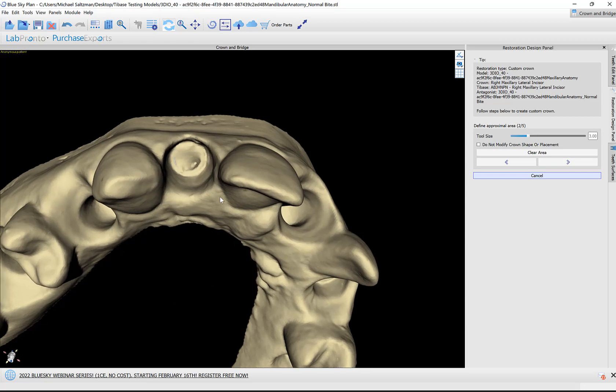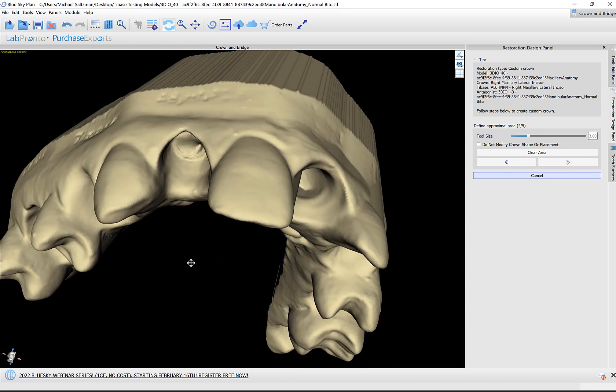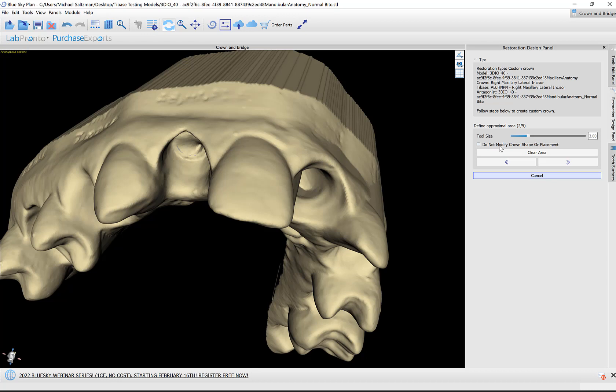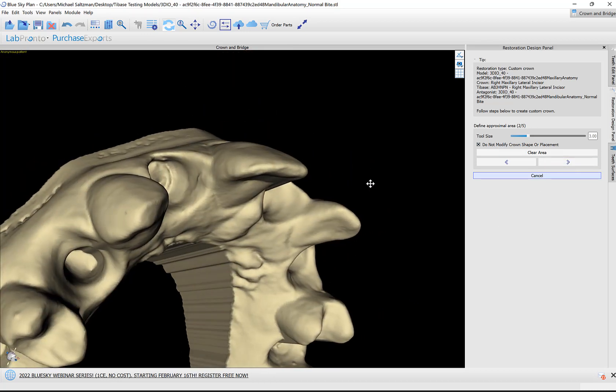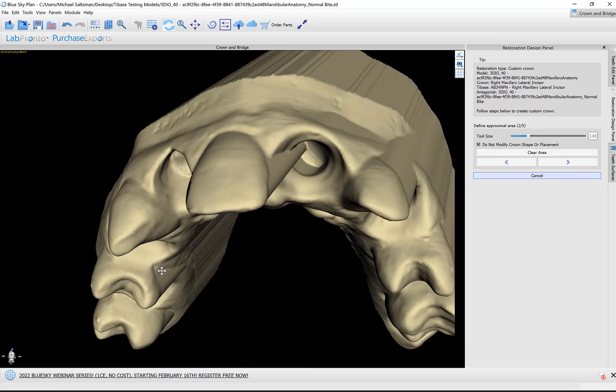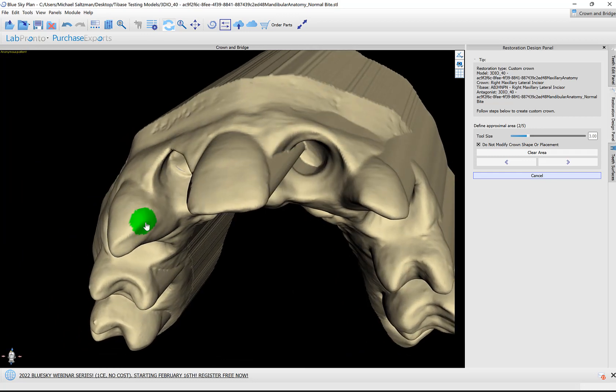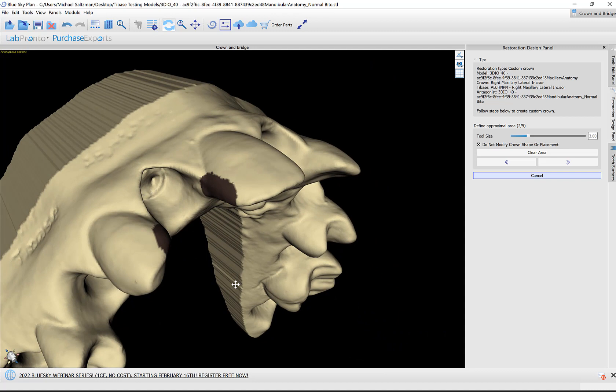We can now define the proximal areas. If you're happy with your previously designed and positioned crown, then you don't even need to do this—just click 'do not modify crown shape or placement' and then click Next. If you would like the software to attempt to resize based on the proximal areas, hold down the shift key, use your left mouse button to paint here the adjacent teeth, and then click Next.